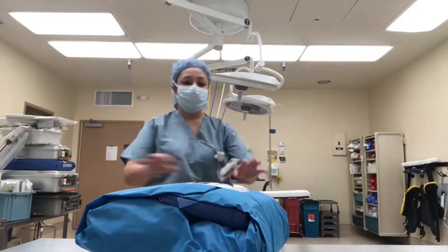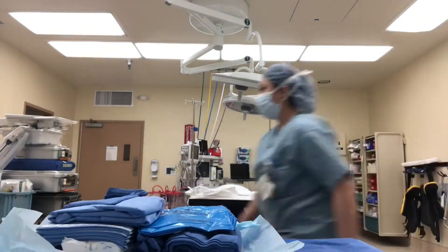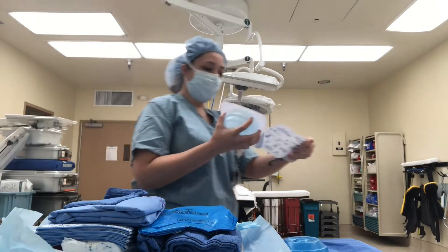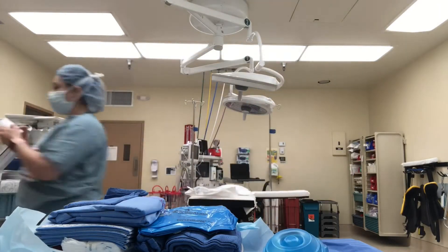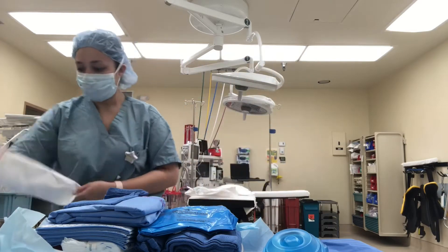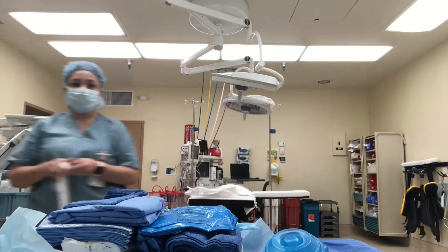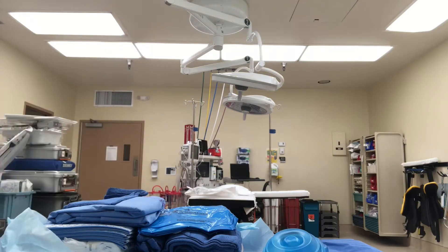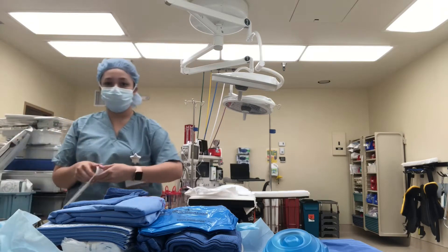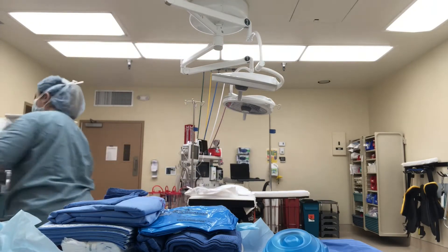Here I am just opening up a pack, which I've shown you guys before. I'm also going to be opening up the bovie, some light handles, and some trocars, which are the device we use to insert into the abdomen so we can get the laparoscopic instruments in. Then we also open up a Veress needle, just to put some air into the abdomen in the beginning.